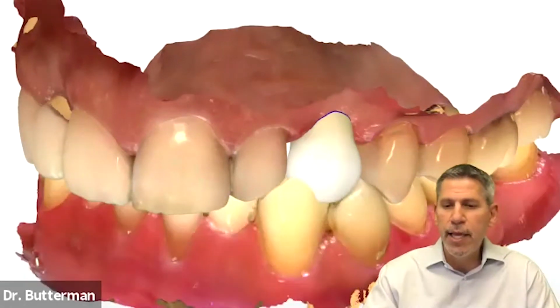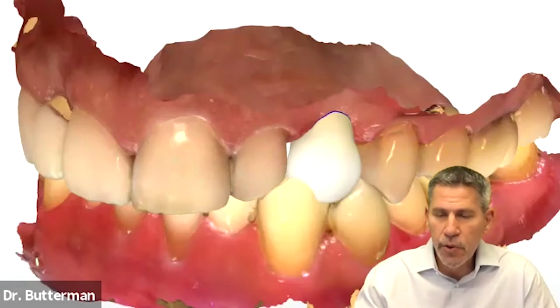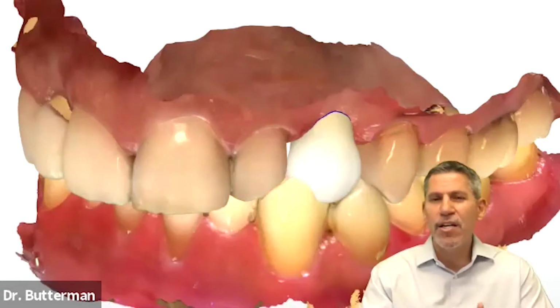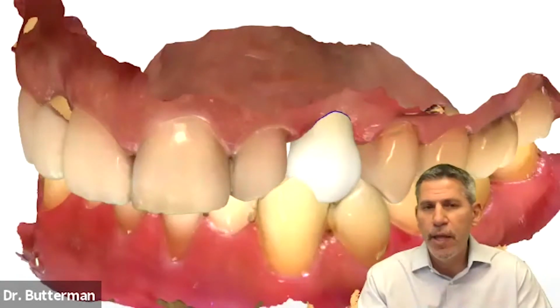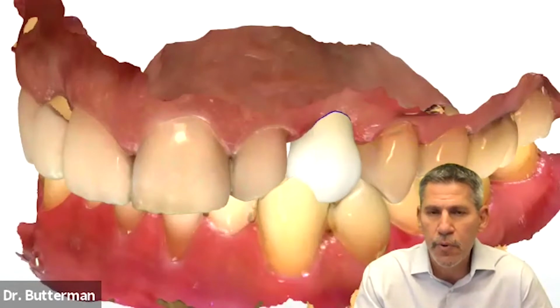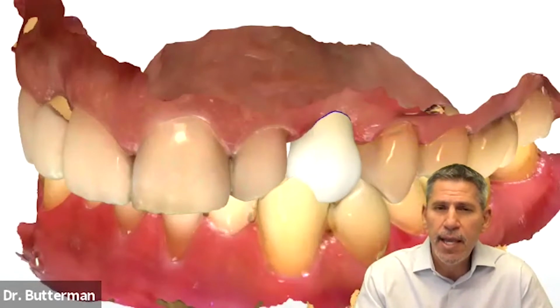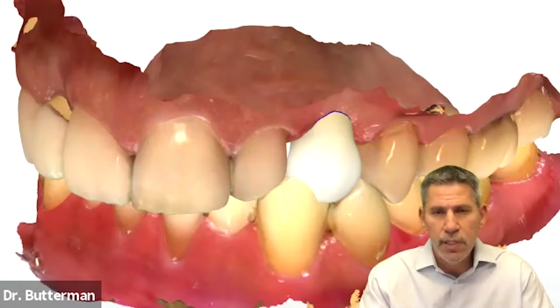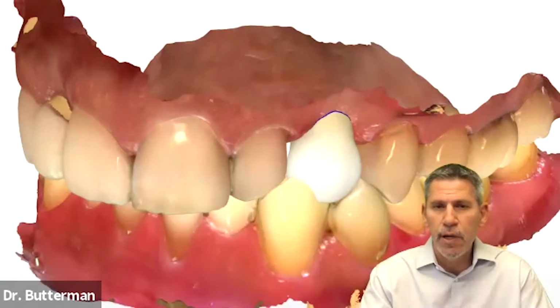And when my assistant did that, she put the lower jaw into place and saw this. Now we obviously don't have enough room. The patient's occlusion is in the way. So I think we've all had discussions with patients, whether it's because of implants or maybe aesthetic treatment that we want to do for them. And we say, hey, you would be so much better served if you would do ortho first. If you would just move the teeth into the right space, then we'd get a better result.